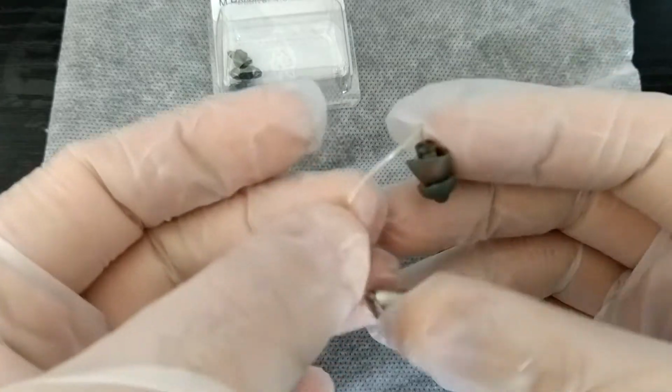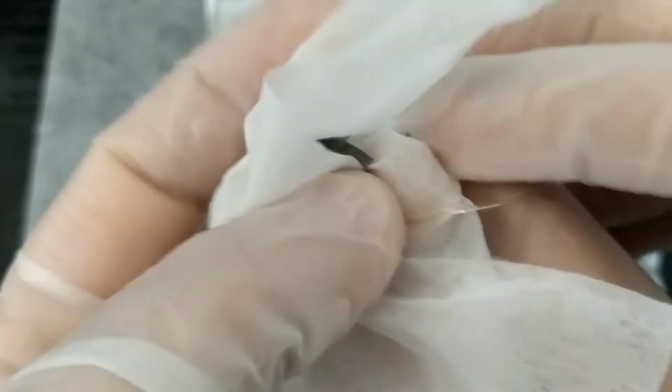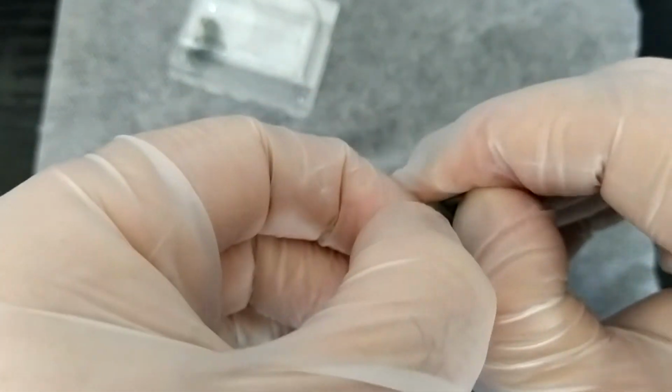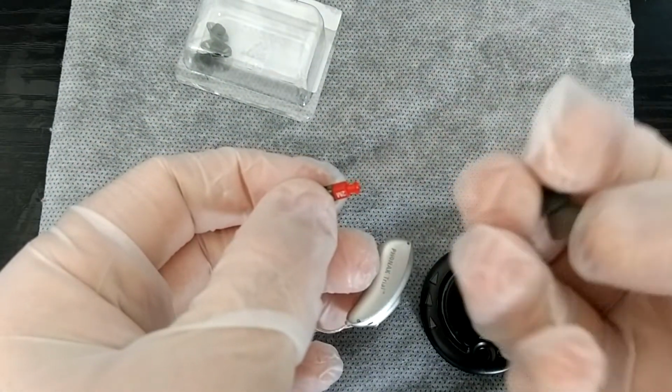What you want to do first is try to give your hearing aid a clean. I usually use some antiviral, antiseptic wipes. Then if you have gloves, use gloves. If not, it's okay. Then you just want to pull off the old dome. So that's the old dome removed there, you can see it.